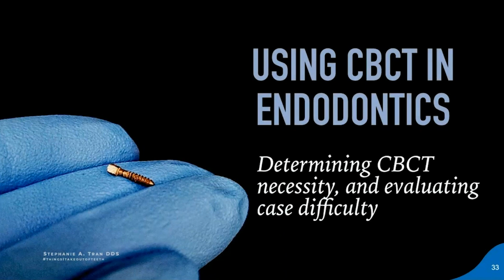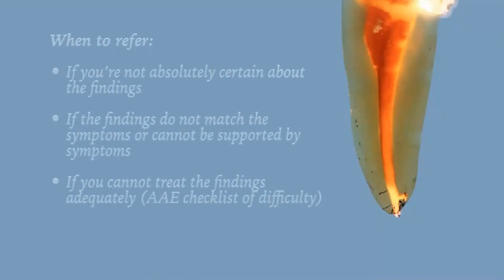When we're using the CBCT in endodontics, we want to know when it's necessary to take a CBCT. I'm not going to go into all the exact indications for all aspects. A few of my previous CBCT lectures do go into a little bit more detail on that, but this is a really good summary of the main reasons when you should definitely take a CBCT, and helps us for understanding the case difficulty and evaluating when to refer.